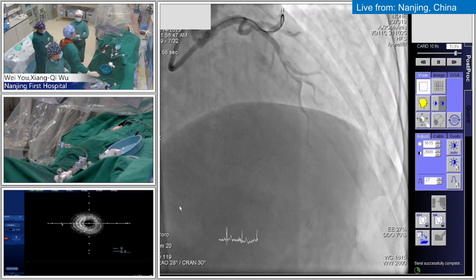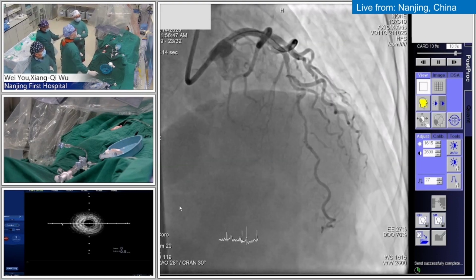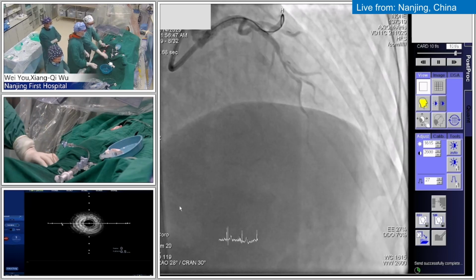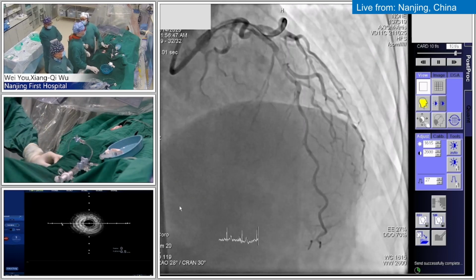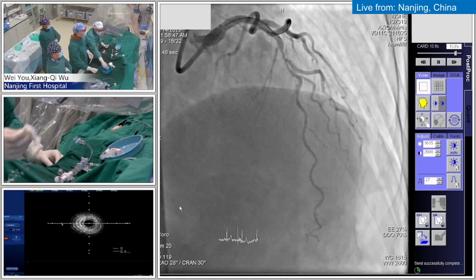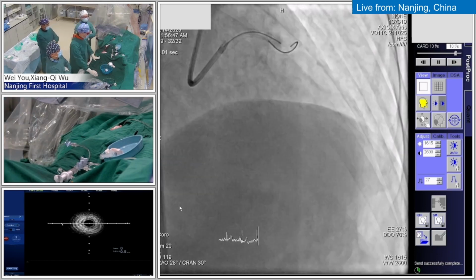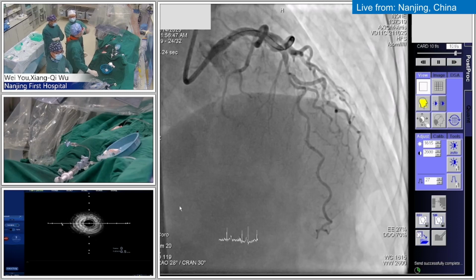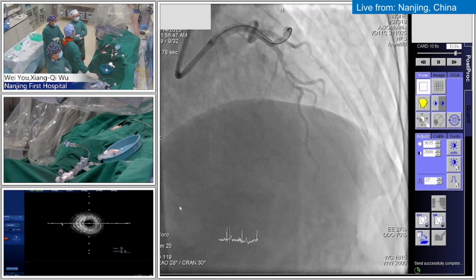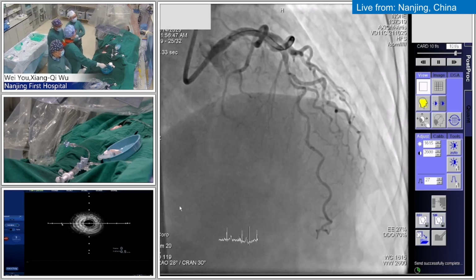Okay, should we make a decision here? I think we need to move to the next site. Exactly. Okay, let's do that. So how about the curve still ongoing? We'll give you a final answer on that. Because we need to download this huge data. How long do you think it would take? I think leave it alone is better. Yeah, I think that is a very good decision.